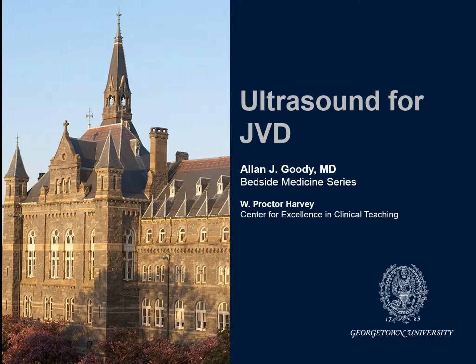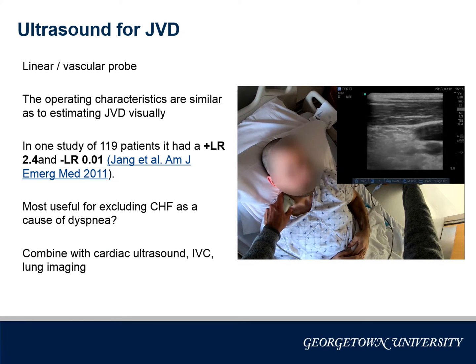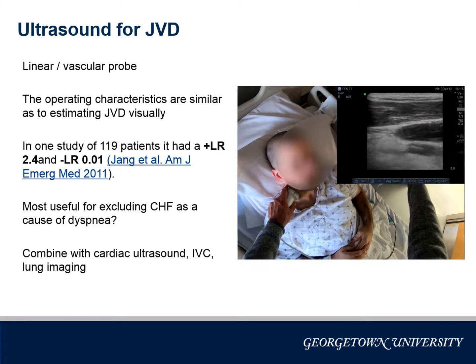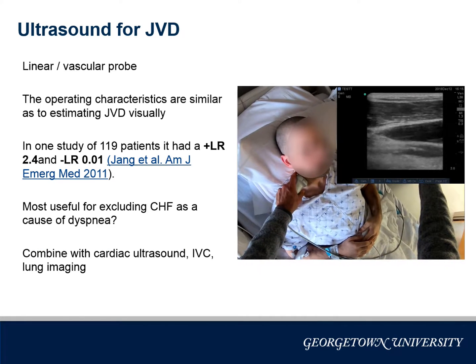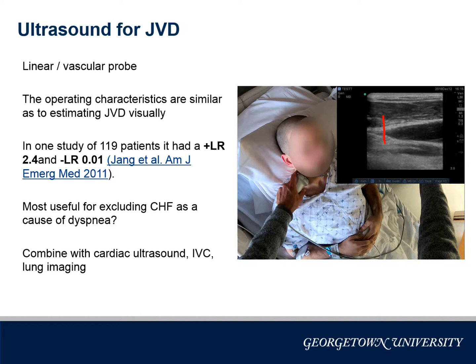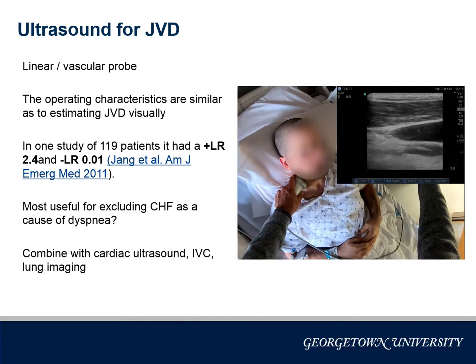This Alan J. Goody Bedside Medicine series video from the Georgetown University School of Medicine is about using ultrasound to find the meniscus of the jugular vein. We will use a linear probe to find the transition point in the internal jugular vein from plump to collapsible. This point represents the same point you would use to estimate the CVP visually.